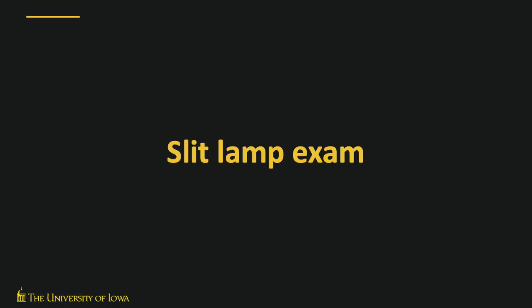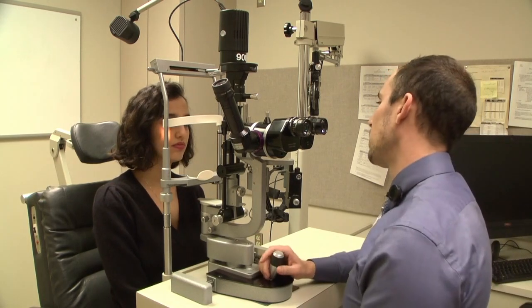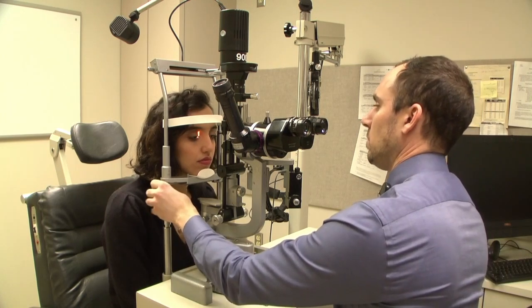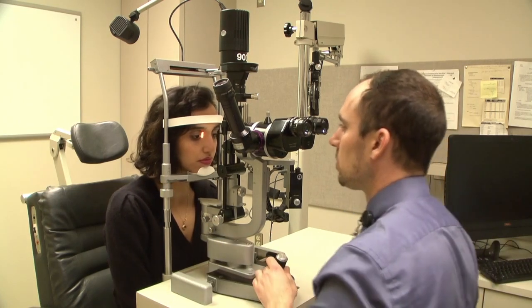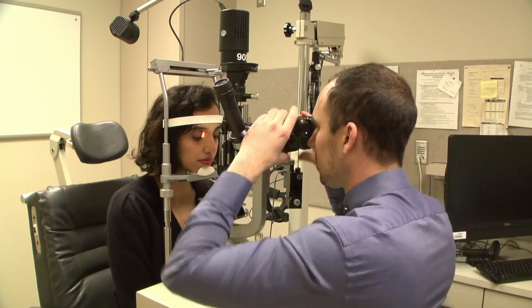Now we move on to the slit lamp. Start by turning it on and twisting the knob on the right-hand side to unlock the base. Ensure the patient is positioned such that the lateral canthus is aligned with the marker on the side of the chin rest with their forehead against the bar. Make sure you are positioned correctly and are not overextended in your neck. Neck and spine problems are common in ophthalmologists.